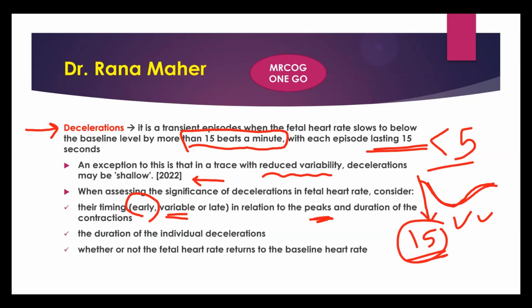Placental insufficiency. No. Variable? Compression of the cord, ma'am. Yeah. Very well done. Cord compression.